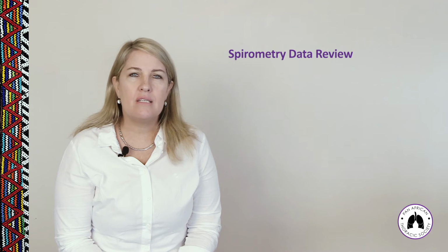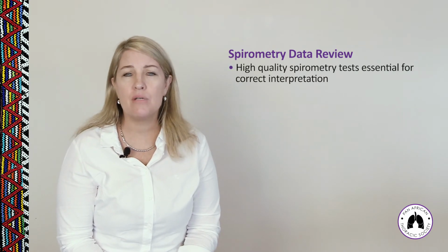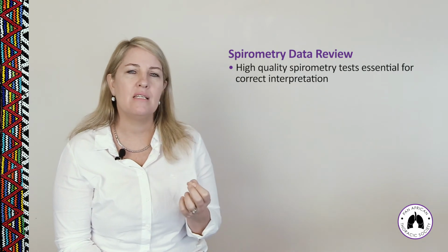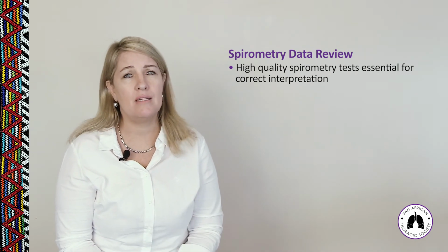When doing audits of your spirometry data, so spirometry data reviews, it's essential that we are gathering high quality spirometry tests, because if we don't have high quality spirometry tests, our interpretation and classification of the child's respiratory health is going to be incorrect.